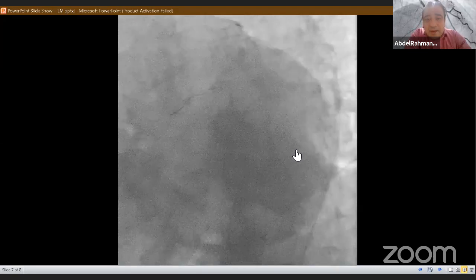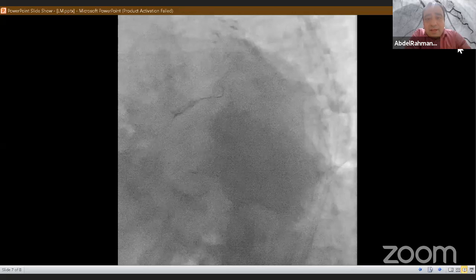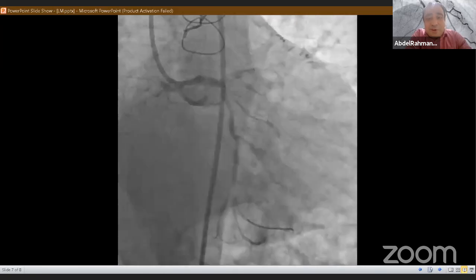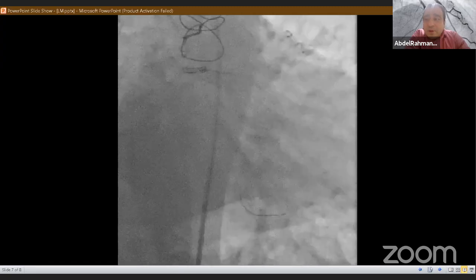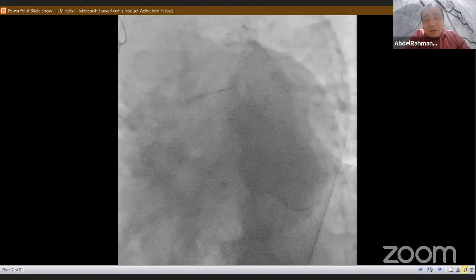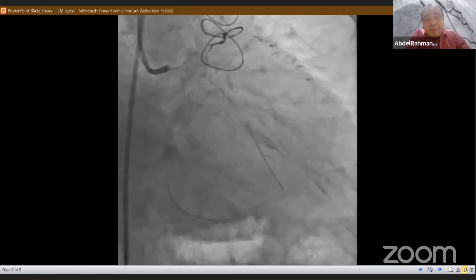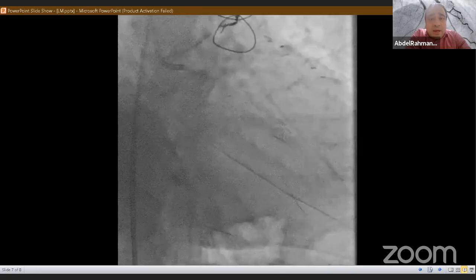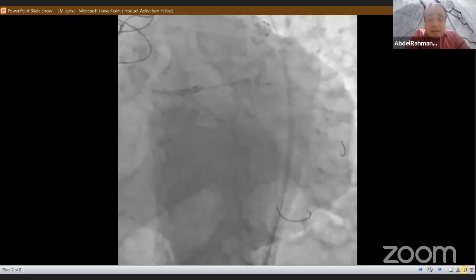May I have a comment, please? Regarding the trifurcation Karim Mahmoud asked about, and the very valuable data Dr. Karim Saeed told us. Actually, we will have a webinar just for the complex trifurcation, which is a more advanced level, mostly of left main disease. I have a few cases in which I used many techniques. I used the 2 guidings, which is called the ping pong technique, so I can do 3 balloon inflation at the same time. Also, we can do stepped or simultaneous kissing between LAD and Ramus and LCX.